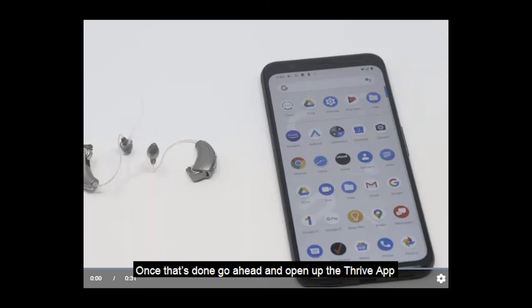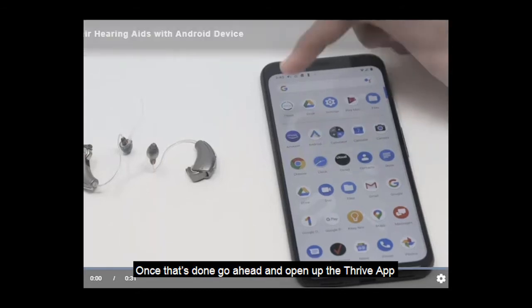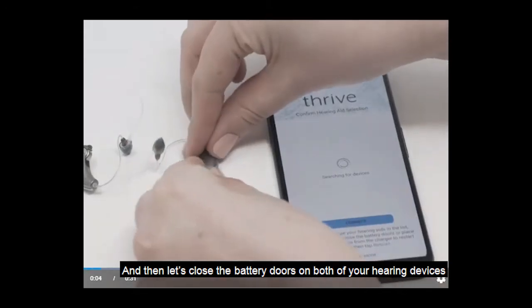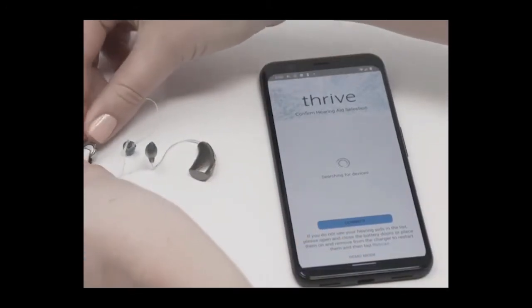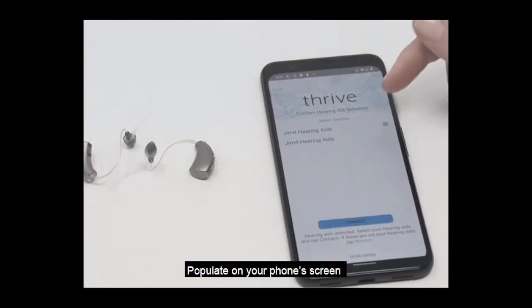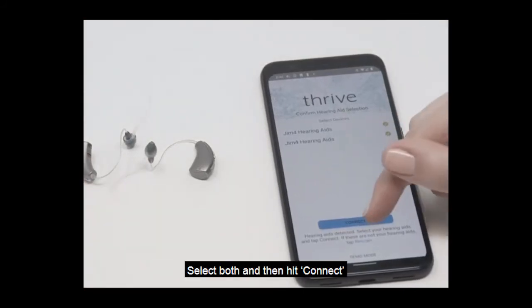Once that's done, go ahead and open up the Thrive app and then let's close the battery doors on both of your hearing devices. You'll soon see the name of your hearing devices populate on your phone screen. Select both and then hit connect.